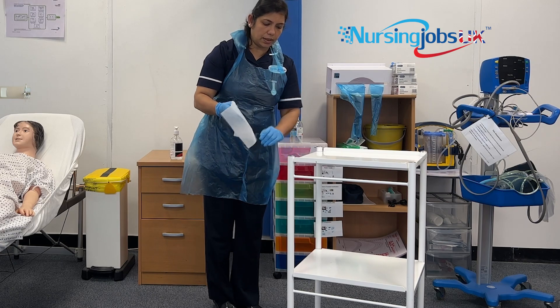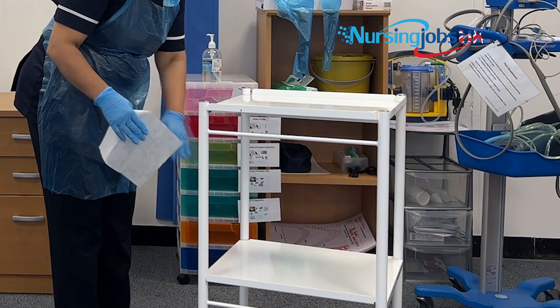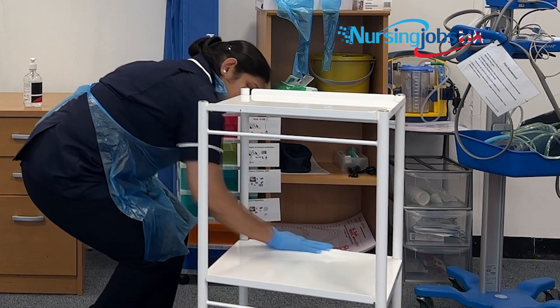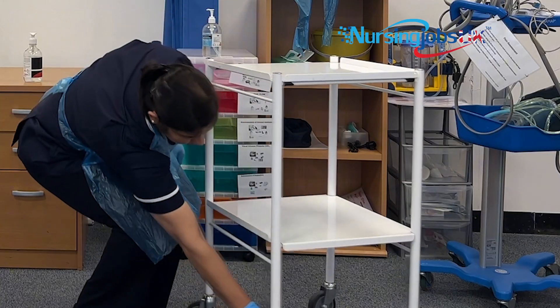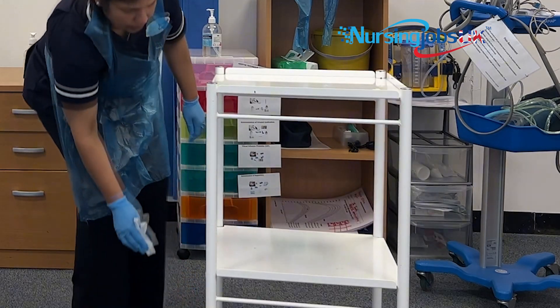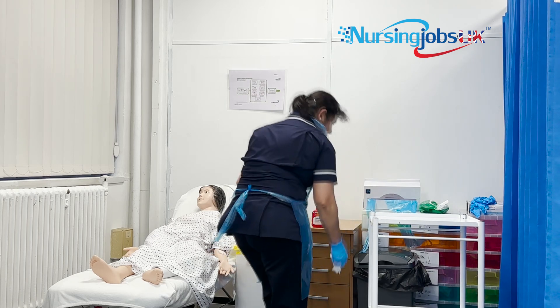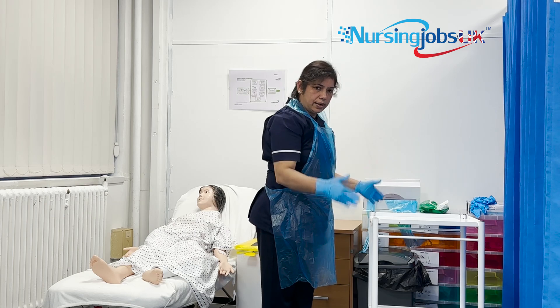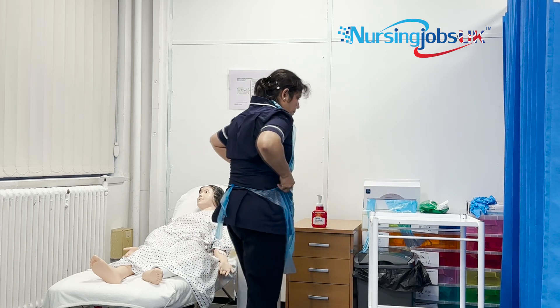Discard the used wipe in clinical waste, then take a new wipe for the bottom shelf of the trolley. Make sure the wipe doesn't bend or touch anything unintended. Clean in zigzag motion — farthest to nearest. Once complete, try not to touch anything you've already cleaned. Then remove your apron and gloves, and gel your hands again.